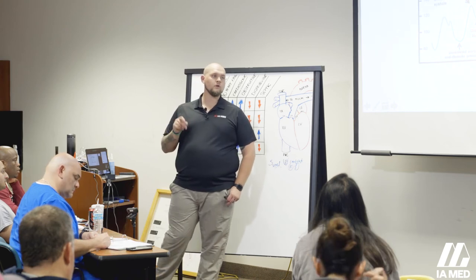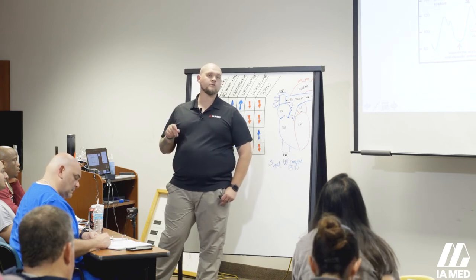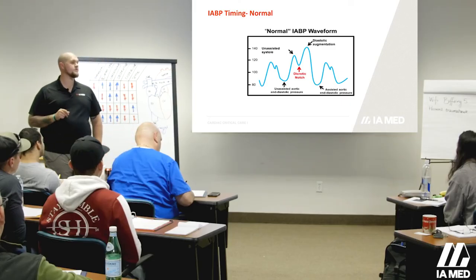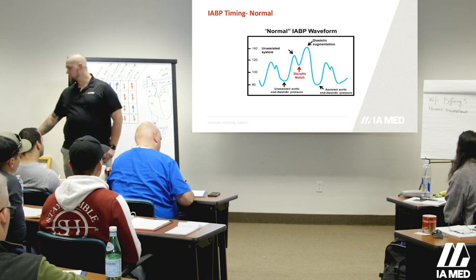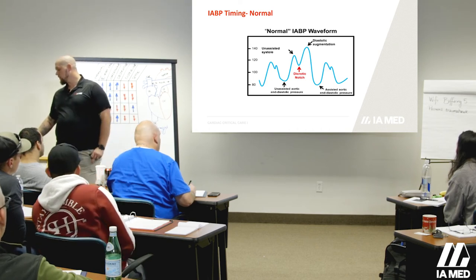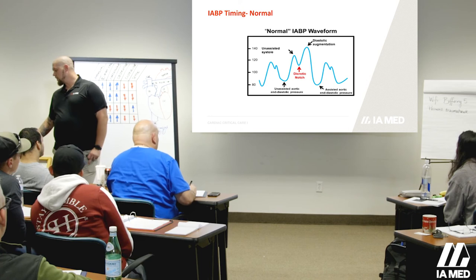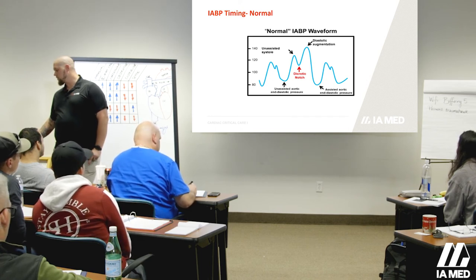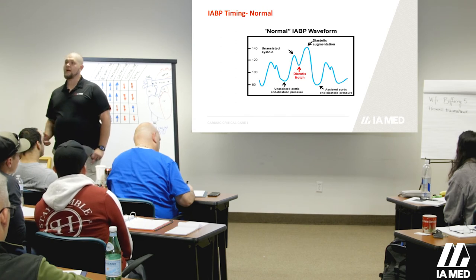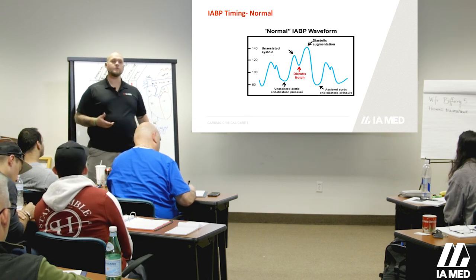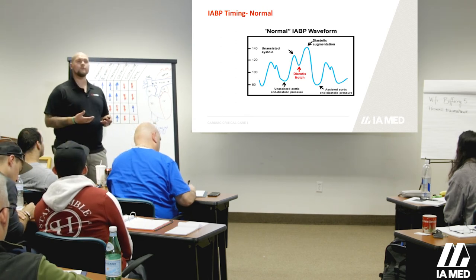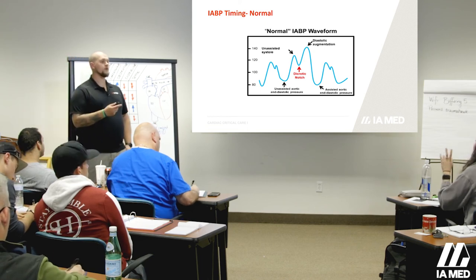If I'm decreasing workload on the heart, would I drop diastole or increase diastole? Drop it. See what's happening here — if I draw this reference line over, I'm drastically decreasing the diastolic pressure. So I know that I'm therapeutic. This is a normal waveform.